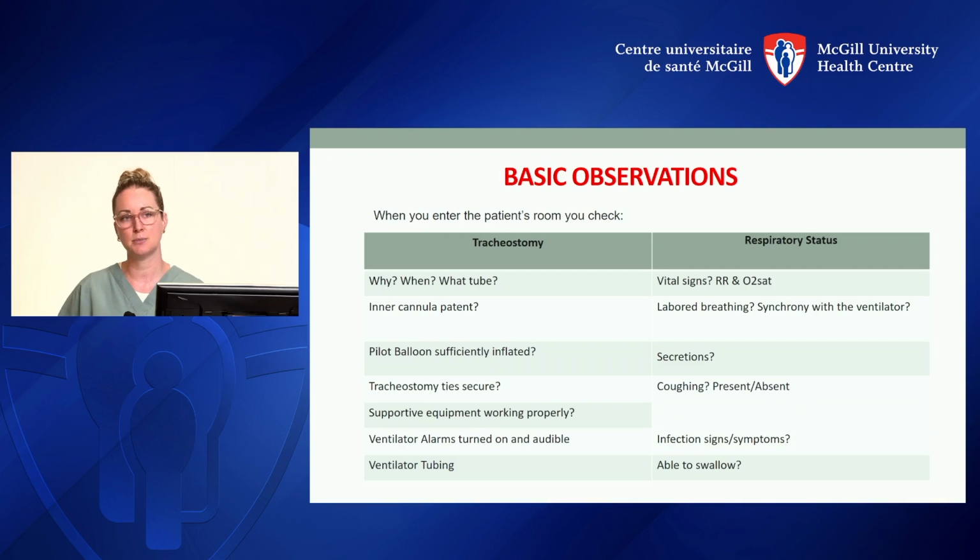That's important because most tracheostomy tubes for the first 7 days will be sutured to the skin. That's to prevent, if there's any accidental decannulation, the tracheostoma is not well formed enough and will close very rapidly. So for the most part, not all, but for the most part, they will be sutured to the skin to avoid that for the first 7 days. And then your tracheostomy tube can be changed after the fact.